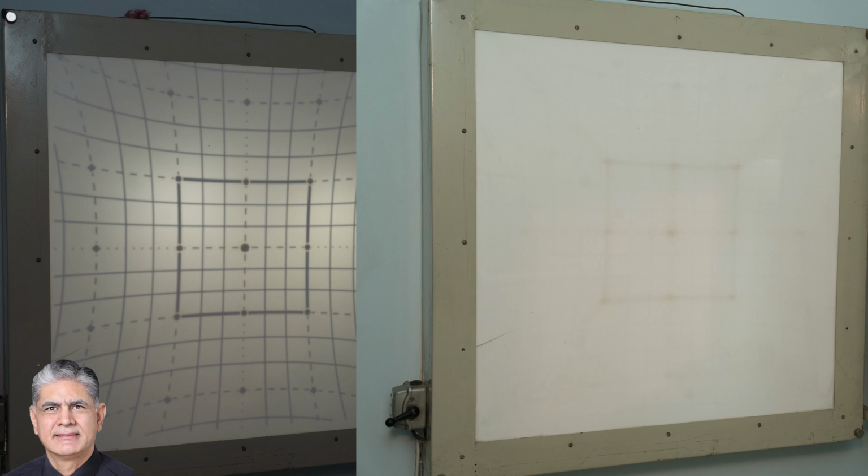What he was trying to do is locate the grid, and he identified on that grid which point was pointed at, which spot was pointed at there, and he then searched out that point on the left grid, and then he placed the stick over there. So this was the problem, and that is why his Hess test became absolutely normal. So this was my last slide.